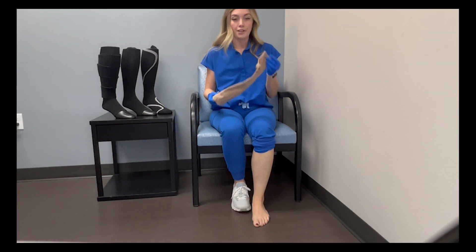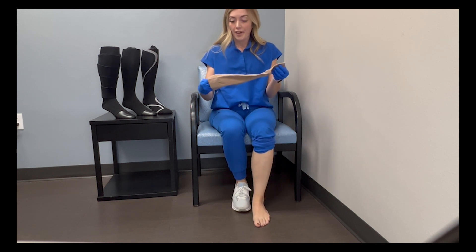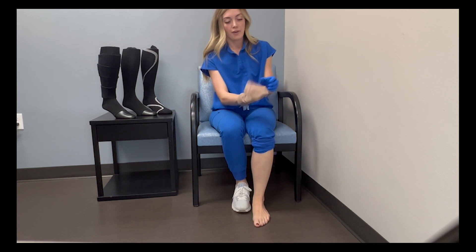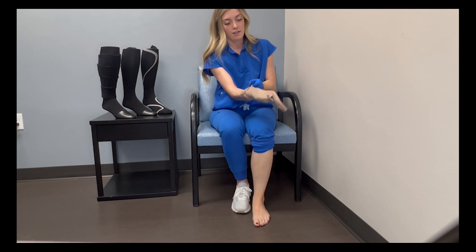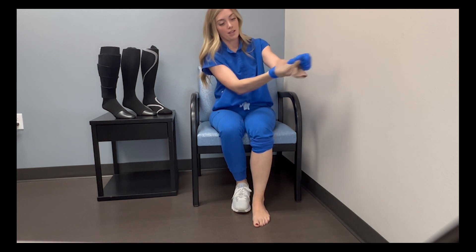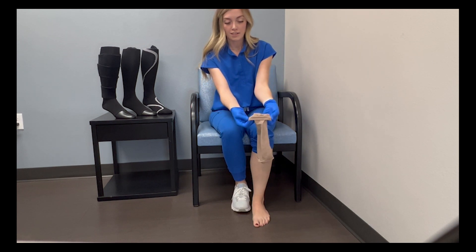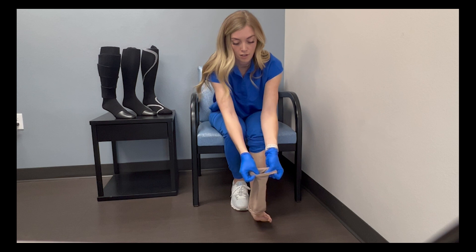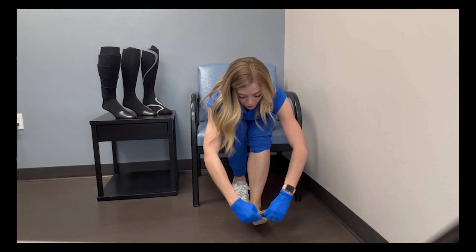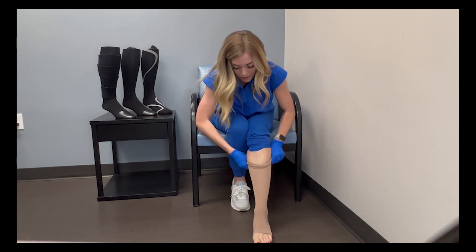This next option is for either open toe or closed toe sock. It's kind of a reverse effect. I'm going to put my hands through with the sock right side out, find my heel, pinch the heel from the inside, and then pull my sock inside out — and here's my heel. I then take this with my heel pointing to the ground, put my foot through the opening, get it where I would like it to be, grab the rest and then pull it up so it's right side out.